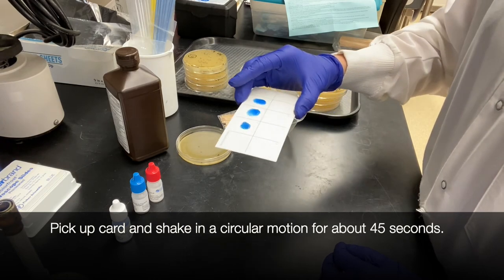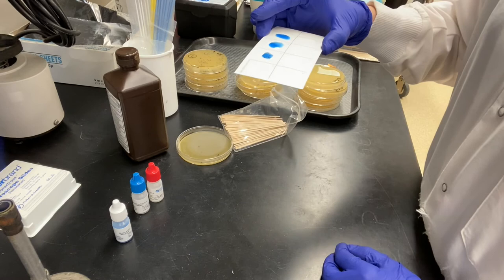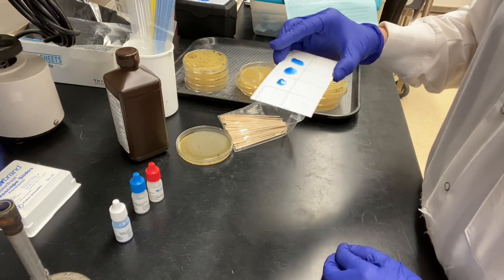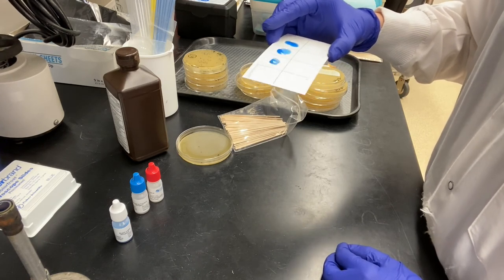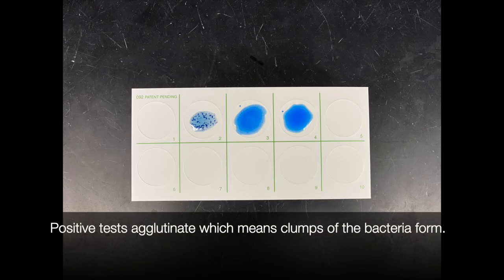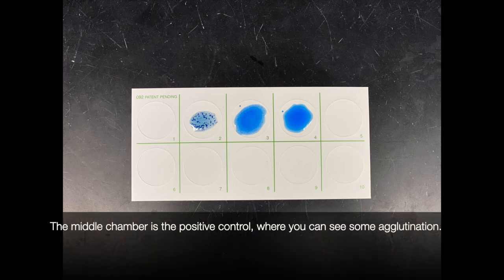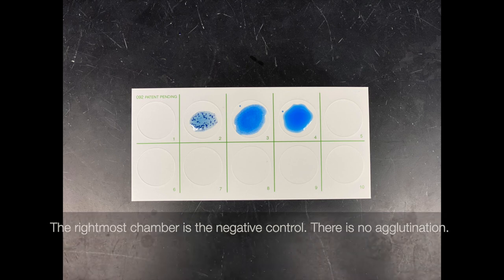Pick up the card and shake in a circular motion for about 45 seconds. Positive tests agglutinate, which means clumps of bacteria form. You can see heavy agglutination from our sample in the left-most chamber. The middle chamber is the positive control, where you can see some agglutination. The right-most chamber is the negative control — there is no agglutination there.